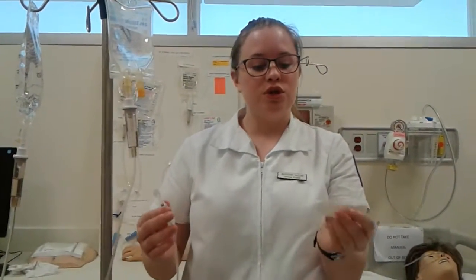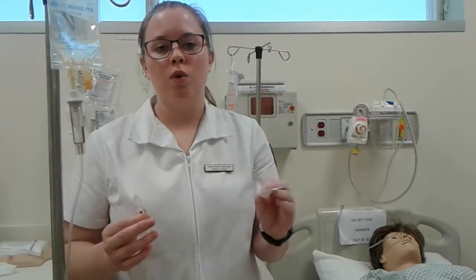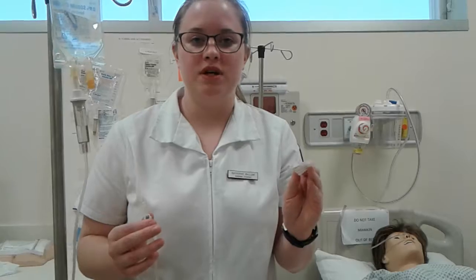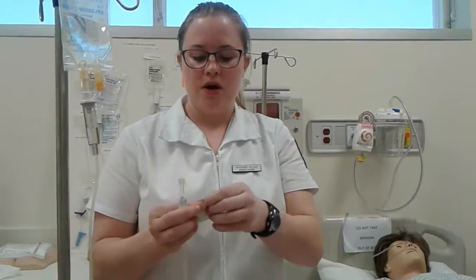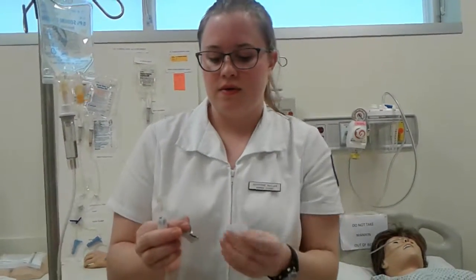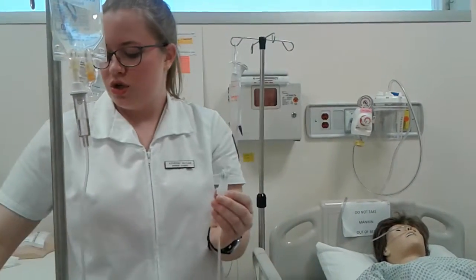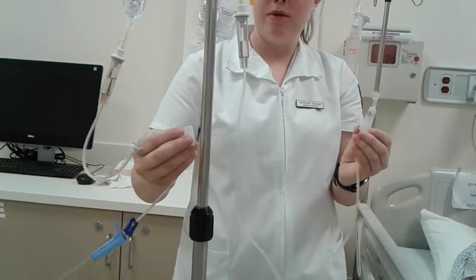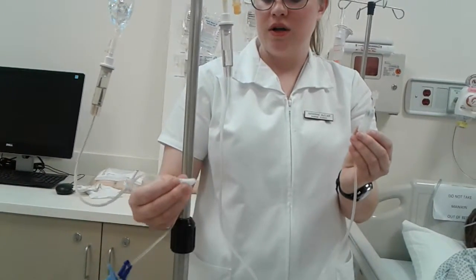I would then move to place my IV sticker on the IV tubing, specifying my name, the date, and the time that it was changed, along with the date that it needs to be changed again. So now, before I continue, I'm going to open my alcohol swab. And I need to swab my primary port for a good 10 seconds, just to kill all bacteria.